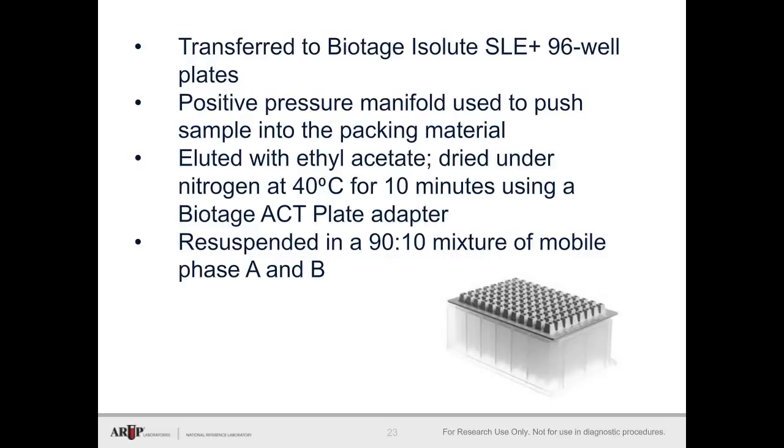We use the Biotage ACT plate adapter because we learned that plates were getting contaminated when there were samples that had really high levels of things like methamphetamine or morphine, and we kind of hypothesized that it formed a cloud and would dissipate over the plate and contaminate wells around it. So this plate adapter seems to have eliminated the problem.